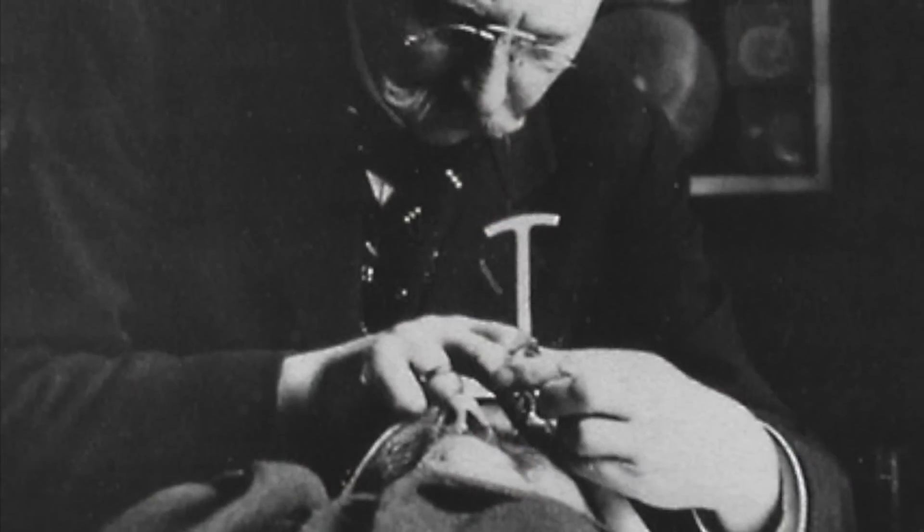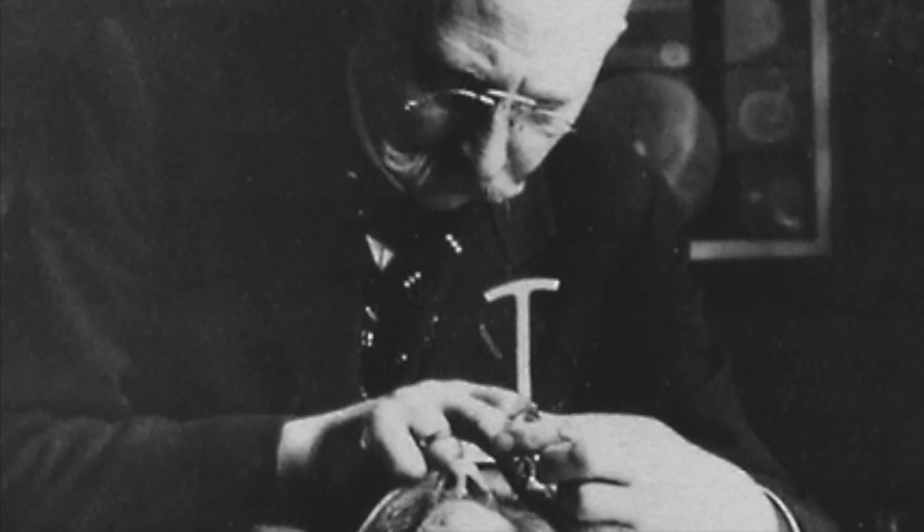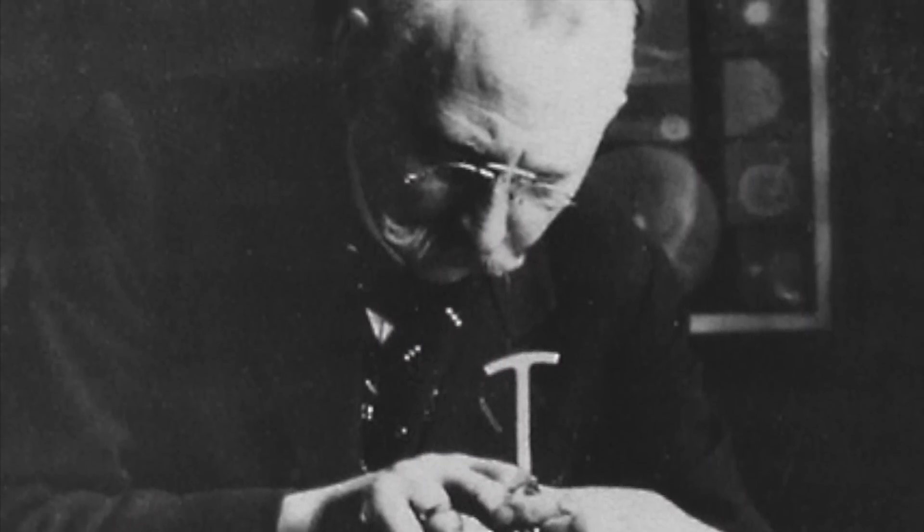Interestingly, doctors were originally trained to estimate IOP by pressing on their patient's eyeballs through the closed eyelid. Starting in the mid-19th century, various mechanical instruments or tonometers were developed for this purpose, including the Schiotz tonometer, which was introduced in 1905 by Norwegian ophthalmologist Hjalmar Schiotz — and I apologize to any Norwegian viewers for completely butchering his name.